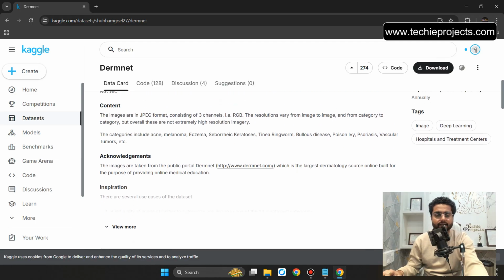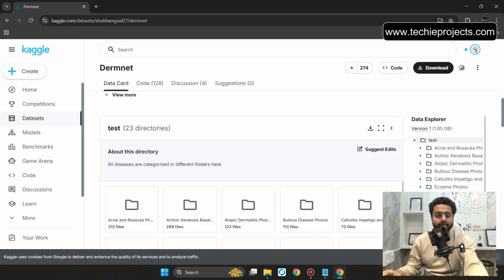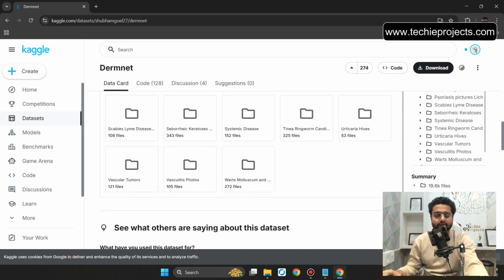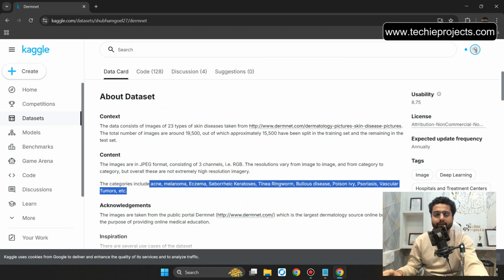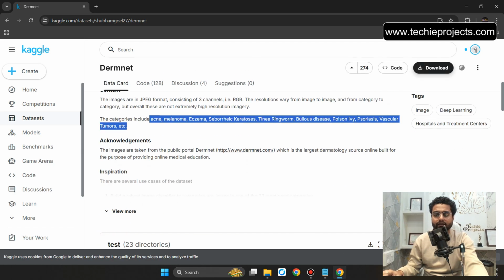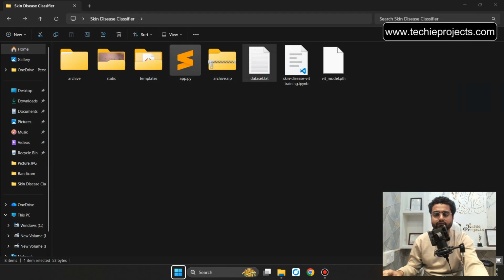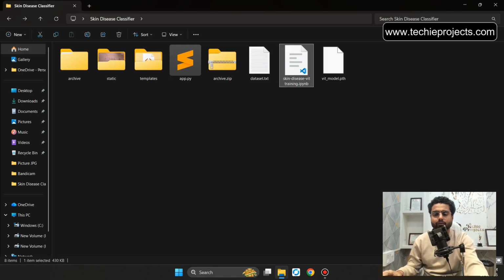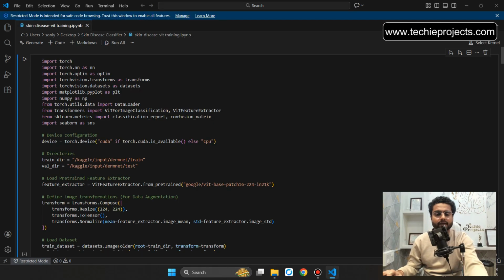Okay, you can see the categories, and those are the folders of dataset. And if you want to download that particular dataset, you have to just click on the download and download the zip. Okay, so let's close that. Close this text file. Now let's open the training file. Now this will be the training code.